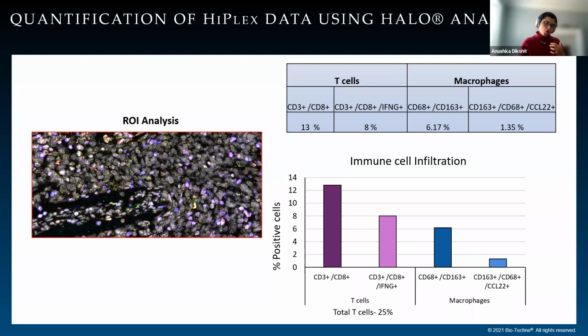So depending on what your ultimate hypothesis is and what your goal is for this assay, you can either count copy numbers for each of the targets, or you can just define phenotypes and percent positivity of those phenotypes within a given cell population. And we are working on developing an app note where we will detail how to best quantify RNAscope signal using Halo.